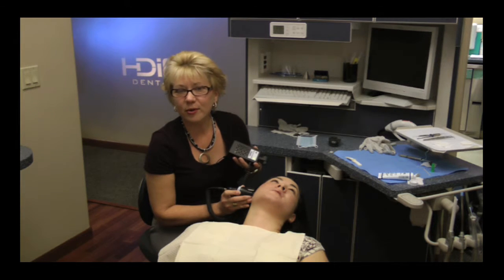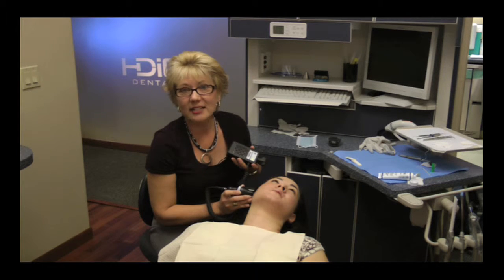So this is a perfect example of one of those unexpected joint sounds. Katie's history was negative for a pop and a click. We didn't feel a pop or a click, but Katie has very definitive crepitus on translation, telling us without a pop or a click that she's off the lateral pole of the disc on this side, and it doesn't reduce. So we would call this a lateral pole disc displacement without reduction.